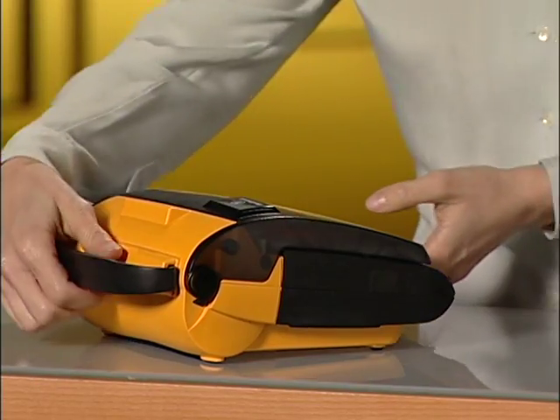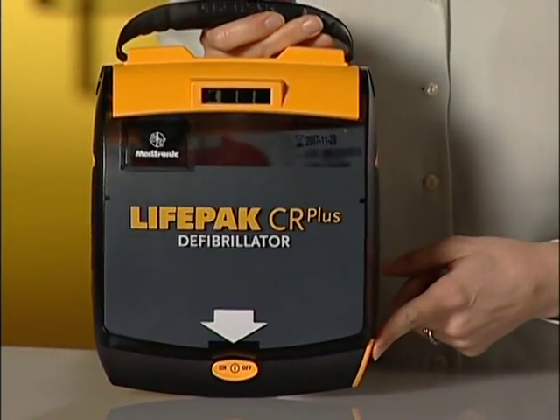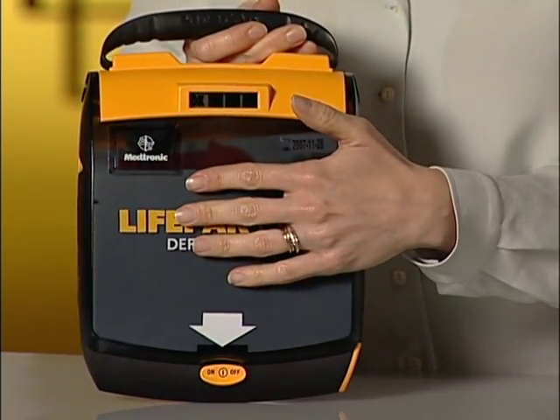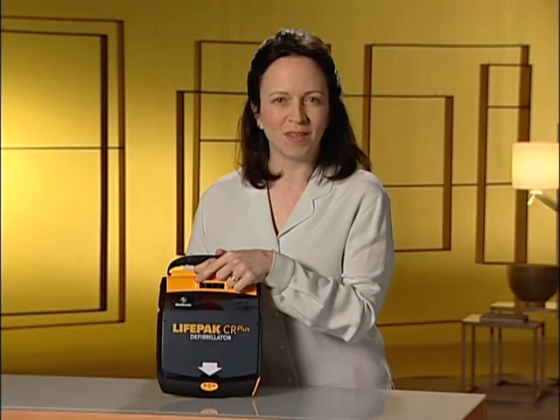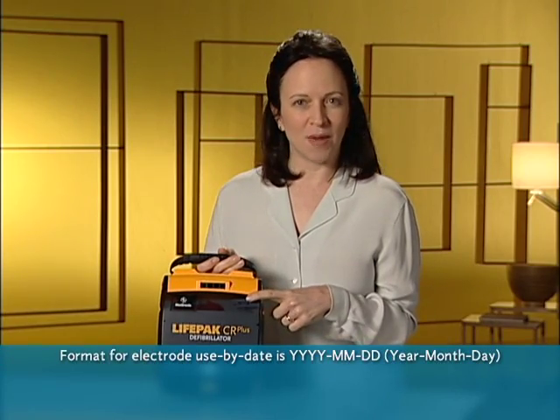The first time you unpack the LifePAK AED, you should inspect it briefly to verify that it responds appropriately and wasn't damaged in shipment. The LifePAK AED comes with the battery charge pack already charged and in place. The electrode pads are also already in place inside the lid. It's ready to use. You can tell by this OK sign right here. Check the OK sign. Check the use-by date on the electrode package. You can see it through this window.